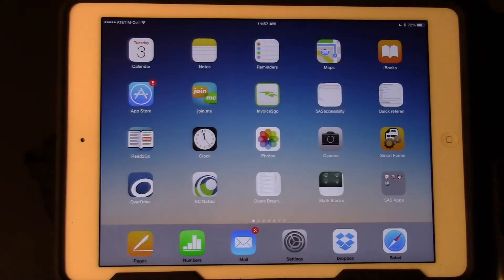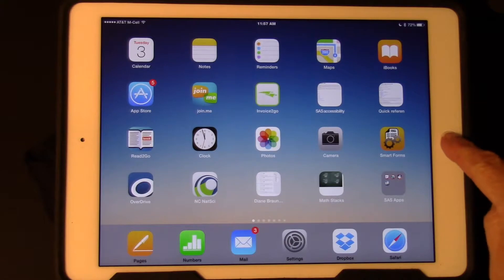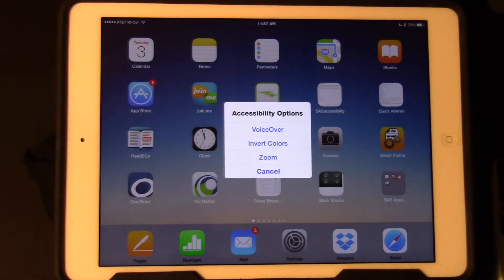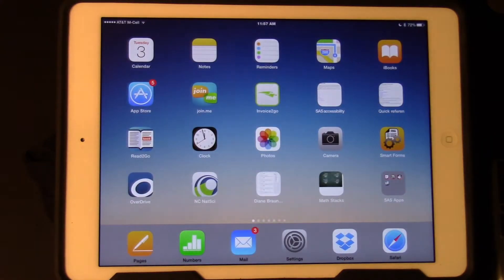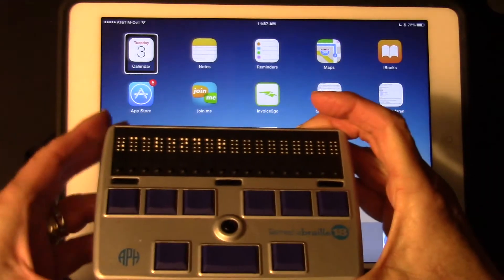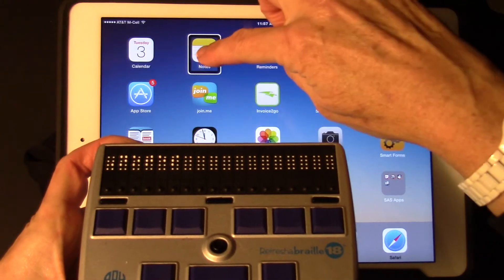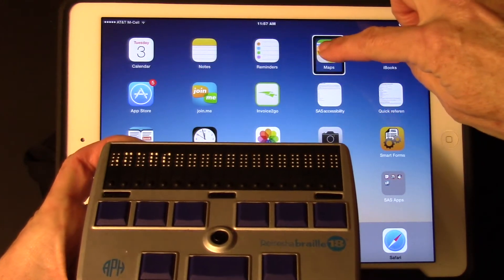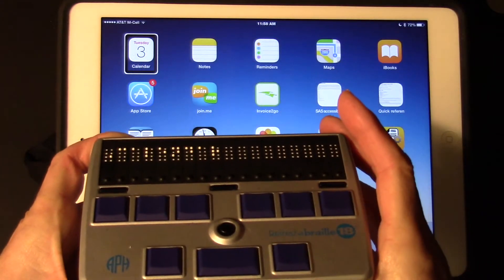We're going to go back to the home screen and turn VoiceOver on. I have previously set VoiceOver to triple click home, so when I do 1-2-3 on the home button, my accessibility options pop up. I'm going to tap on VoiceOver. Now you can see that my refreshable braille display has paired. The braille will display the same thing that VoiceOver says.